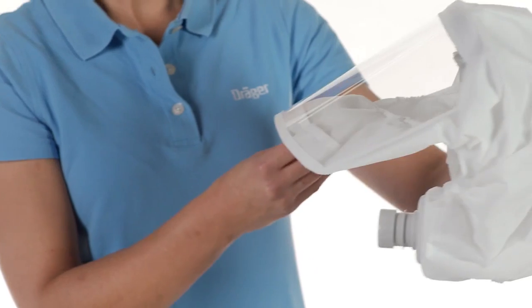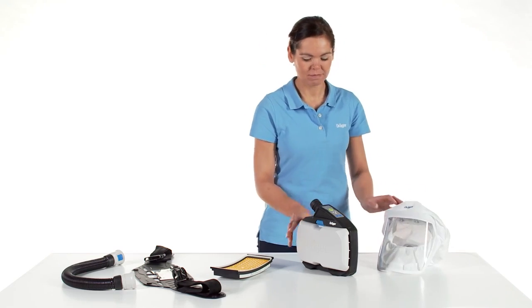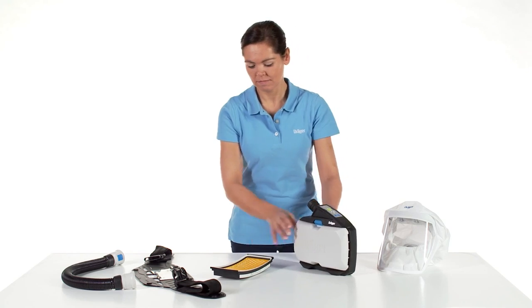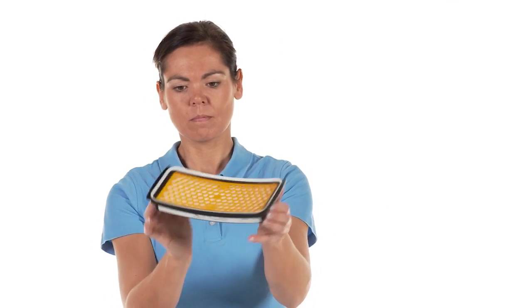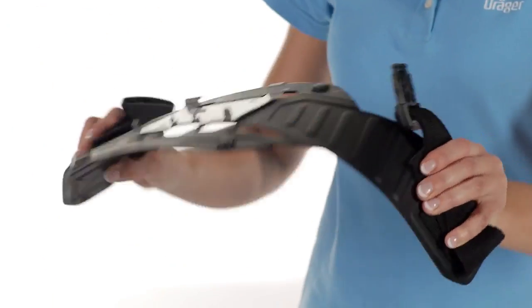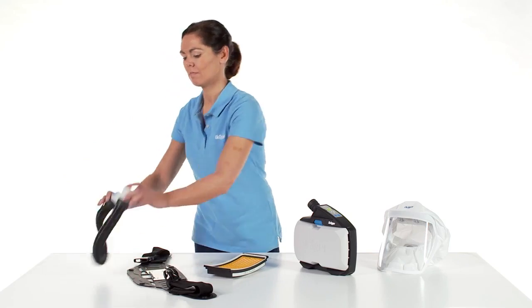Outside the hazard area, select the components of the powered air purifying respirator according to your required protection level and your application scope. After making your selections, perform a visual inspection and functional test.